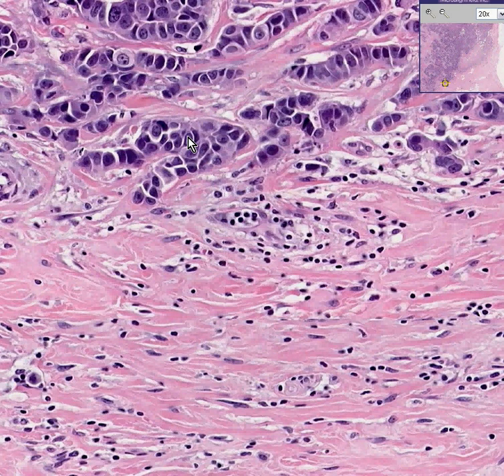In addition, all these little pinpoint cells here out within the fibrous tissue, here's a fibroblast, here's a fibroblast, probably. But the little round cells are just scattered nests of lymphocytes, because like most tumors, the body wants to fight it with its own immune system, i.e. lymphocytes. So generally speaking, the more lymphocytes which cuff or battle or surround a tumor is often associated with a better prognosis than when these tumor cells just go out invading and there's no little soldiers out here to fight them. Thank you very much.